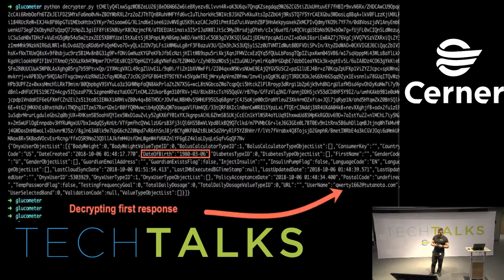And so this is only one sample of the requests, where when you decode it, it gives you like the date of birth, the gender, there's some insulin dosage stuff. But then there's a bunch of other requests that synchronize your previous glucose reading levels, how much insulin you actually need, and that's where it gets a little bit dangerous.